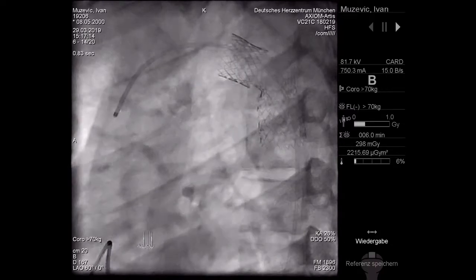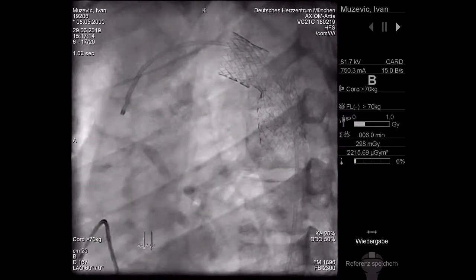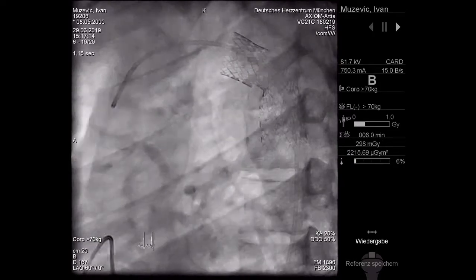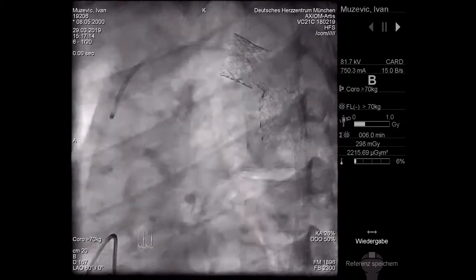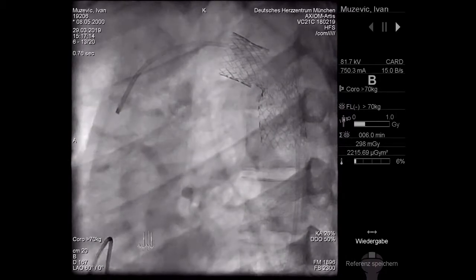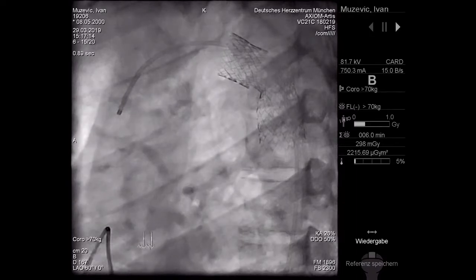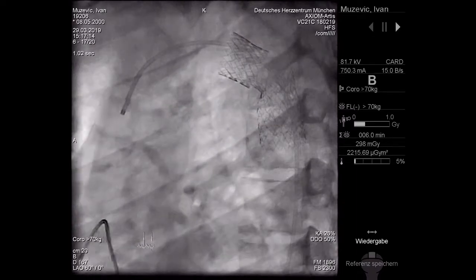So Oliver, what would you suggest? I would probably vote with Jacques that you should take another stent and cover the two, and then work on the subclavian and then blow it up with an Atlas. But if you use the Atlas now, I think you will dislodge the just placed first stent. So this is my concern as well.